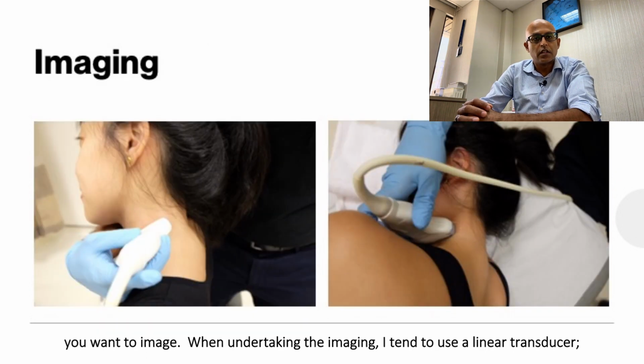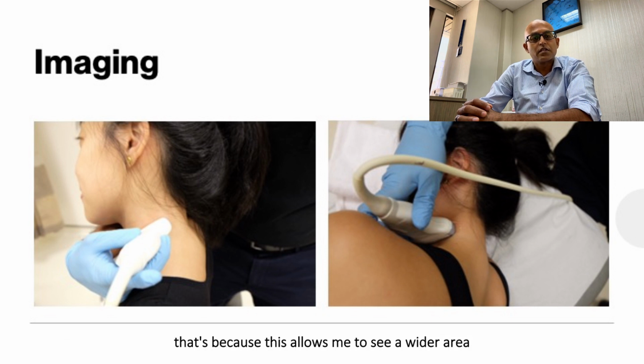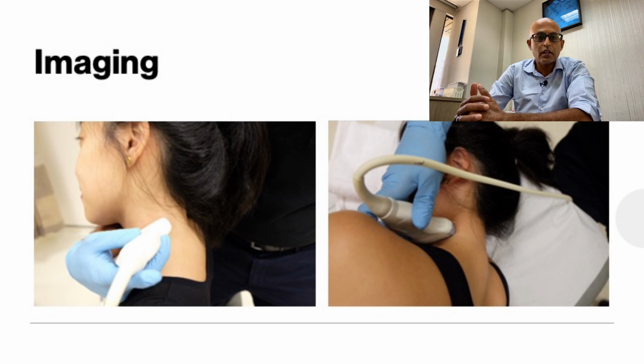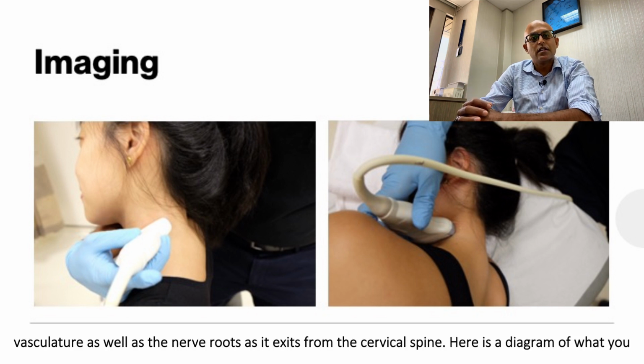When undertaking the imaging, I tend to use a linear transducer. That's because this allows me to see a wider area, and also it allows me to evaluate other structures, including the vasculature as well as the nerve root as it exits from the cervical spine.